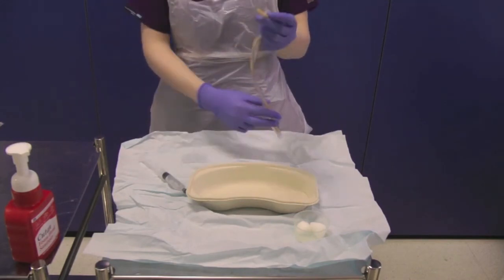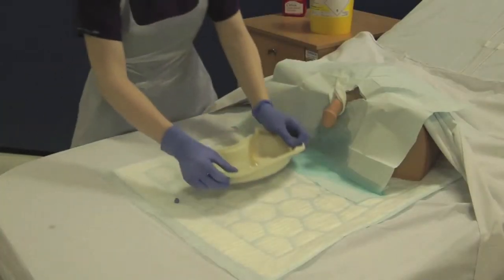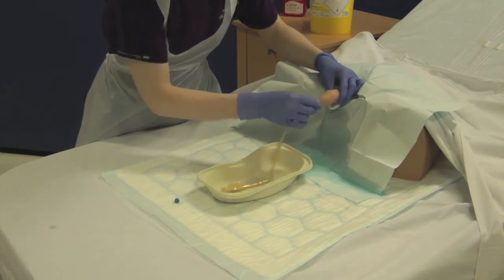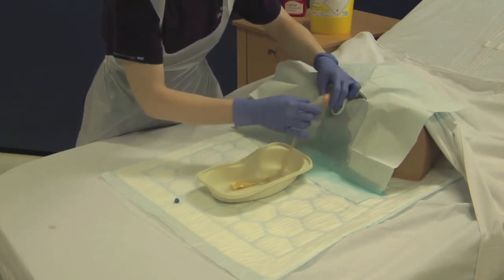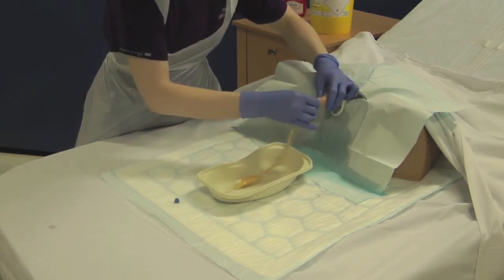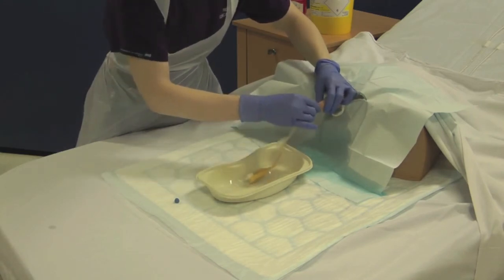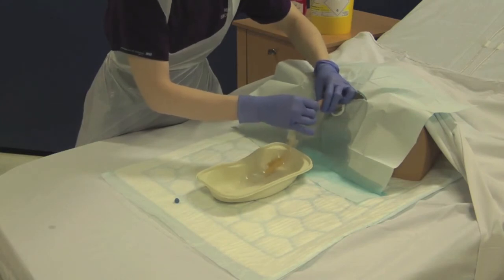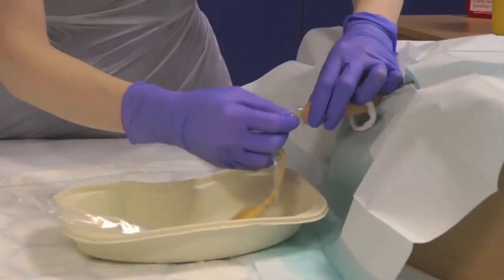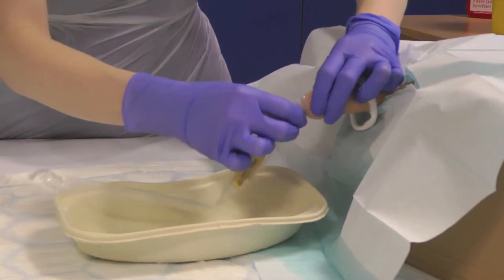Hold this in the sterile J tray and place onto the bed between the patient's legs. Avoid touching the catheter directly, using the packaging as a barrier. Hold the penis erect and insert the catheter along the urethra into the bladder. If there is any resistance, ask the patient to cough, which may ease insertion. Never force the catheter. Once the urine starts to flow, advance the catheter a further 5 centimeters.